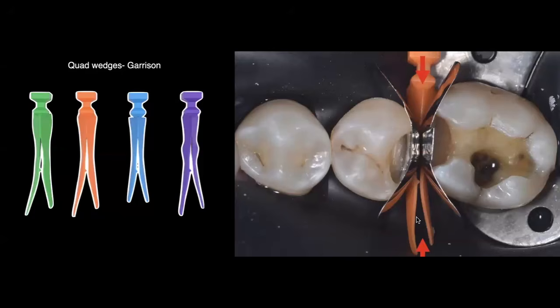Now, for this particular case, because I told you that I was going to use these stiffer bands, you can see that you have 4 different sizes for this quad matrix system, and I have used the quad wedge, the orange quad wedge, which is the second in size. So this is going to give me enough pressure in between these bands in order for me to be able to recreate that contact tightness that I want when I add the force created by the wedge as well as the force created by the ring.